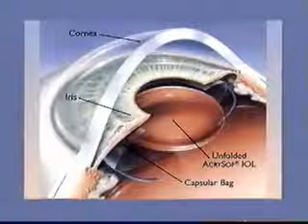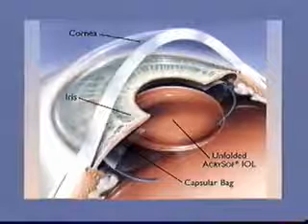unfolded, and eventually placed into a perfect position into the remaining capsular bag, or the outside casing of the lens that is left. Here the eye is reinflated with fluid and the procedure is complete.